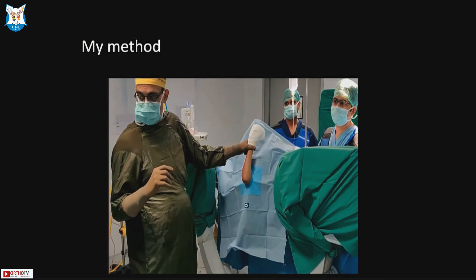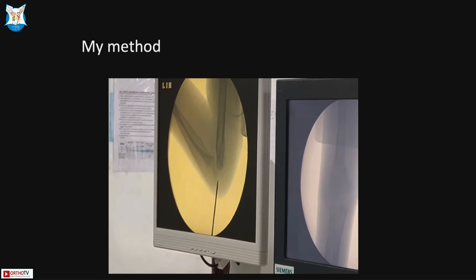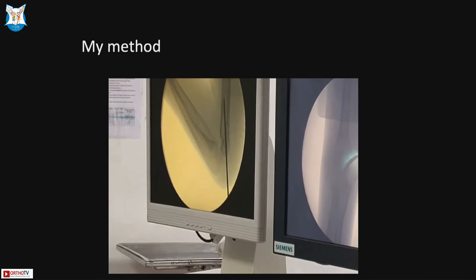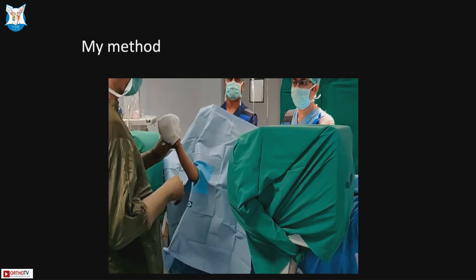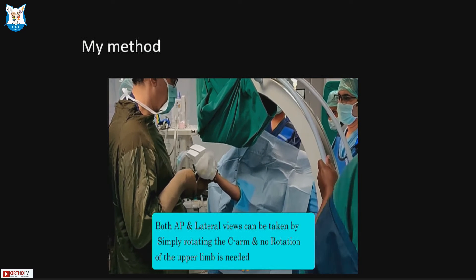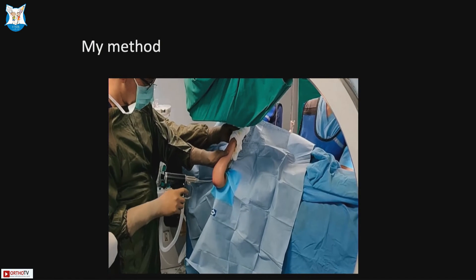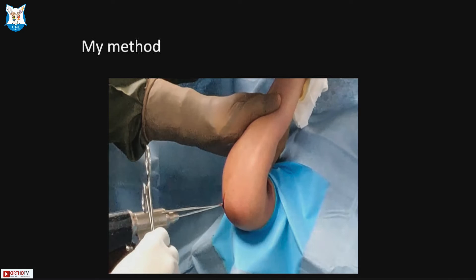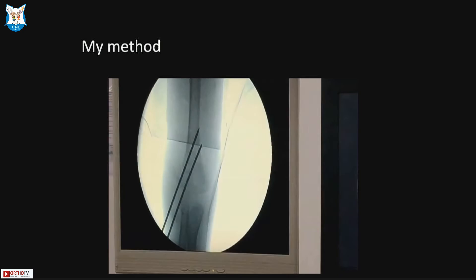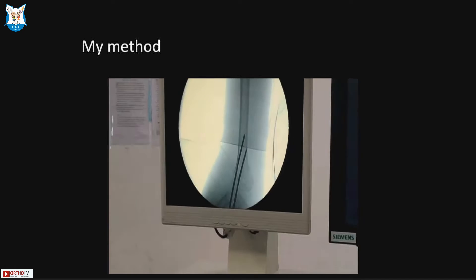After antiseptic preparation and draping, the first pin is passed through the fossa in the lateral profile with the elbow flexed, slightly anterior to posterior — this is the fossa cortex pin. The C-arm is turned 180 degrees to the AP view to confirm pin position. The second pin is placed parallel, about 8 mm away from the first, through the column. External rotation is then used to confirm rotational stability, which is very good.